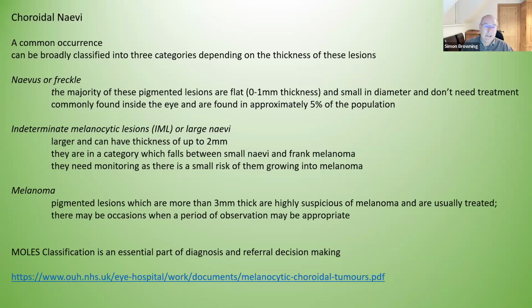Because he had to monitor them to be sure they were changing. It was a lovely tongue-in-cheek letter, but be aware that you will see lesions much, much earlier on using these devices, and therefore there's nothing wrong with these being monitored before we can be sure.